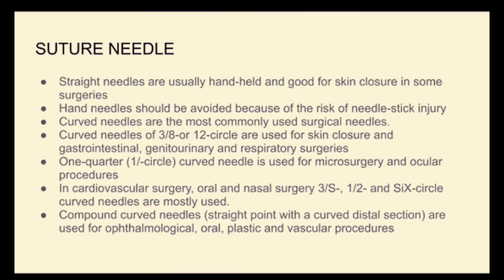How do I explain it? Because it's curved, it's like the body of the needle. There are different types. There's 1/4, there's half, there's 3/8. So it's based on how much of a circle it forms. So the 3/8 will form a quarter plus an extra curve.